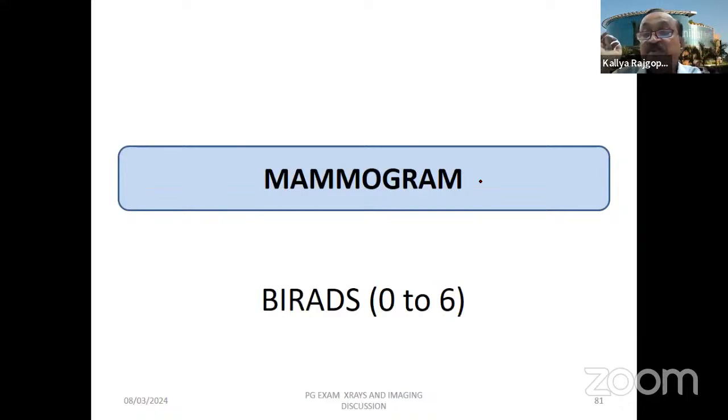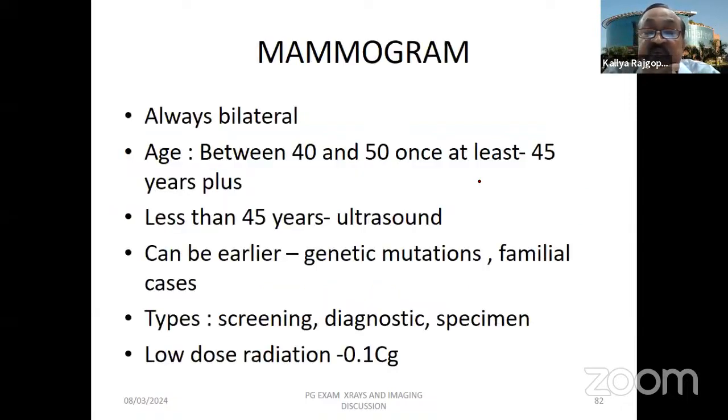Right. So this much information is enough for the time being for you postgraduates. Basic ultrasound of the breast, ultrasound of the thyroid, and of course the appendix I mentioned to you. As I mentioned, there's no end to learning. You can continue, but basic principles have to be kept in mind. I will go to some more things now about mammogram, because another commonly asked question is the breast imaging reporting and data system. This ranges from 0 to 6. 6 is ultimately proved by the pathologist.